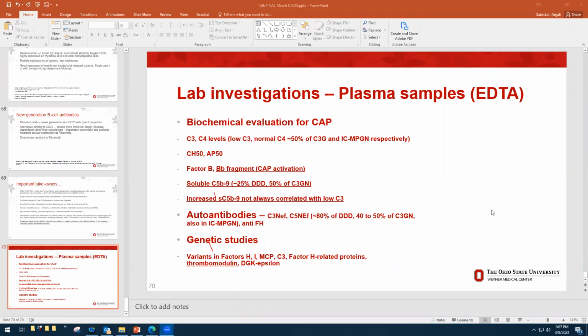We never found any obvious infection. And the fact that this disease was coming back again and again, recurring, it was very unlikely that it was infection. Our only confusion was that the very first biopsy was in 2007. At that time, we didn't even have this classification of C3GN. Yes, true. But when she came back again in 2018, somehow this PGNMID, we were thinking of it a lot because of the staining pattern, IgG and monoclonal staining.